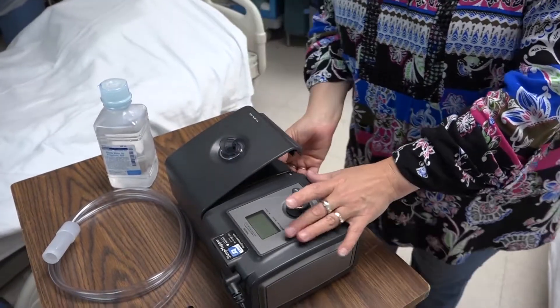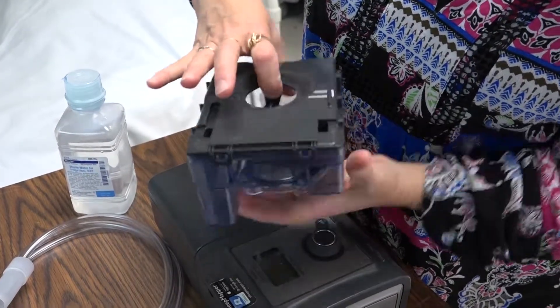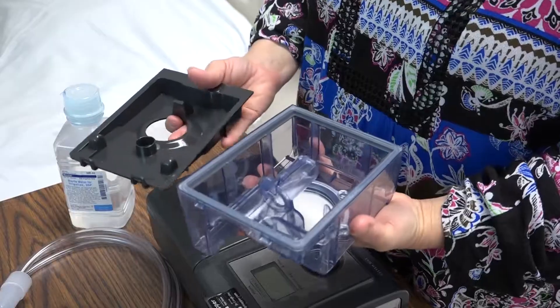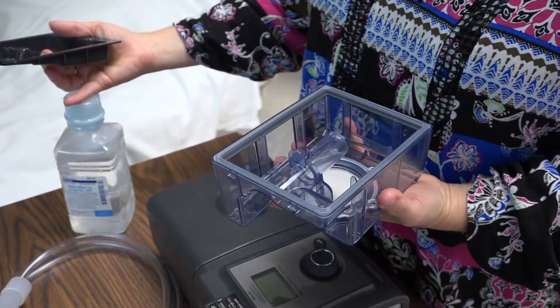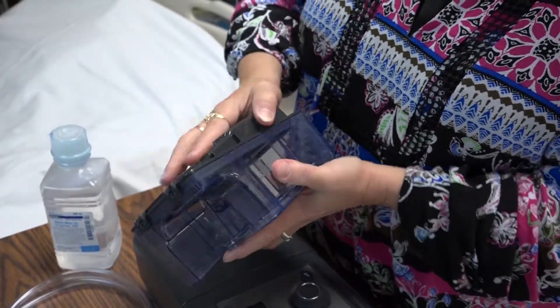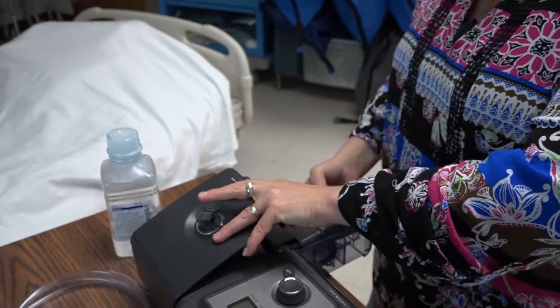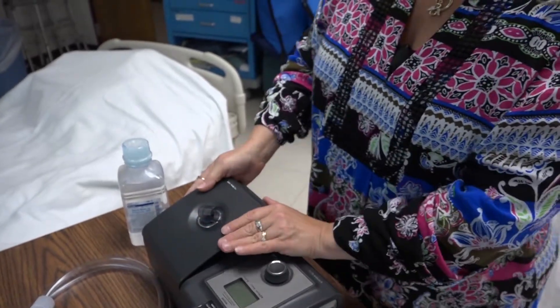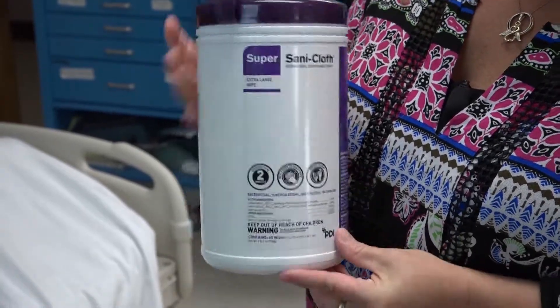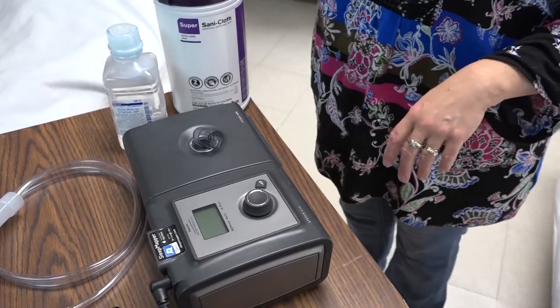To clean the humidifier chamber, open up the chamber and remove the humidifier by pushing in on the release spot and gently lifting it up. Drain out any excess water, wash it with mild soapy water, rinse again with sterile water, and when you refill it, fill only with sterile water. Place it back into the machine with the water in it and it will be ready for use. If the machine becomes dusty, take a wet wipe, gently wipe the outside, and let it air dry.